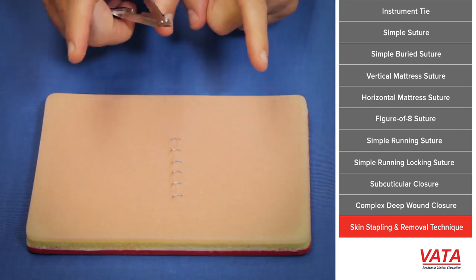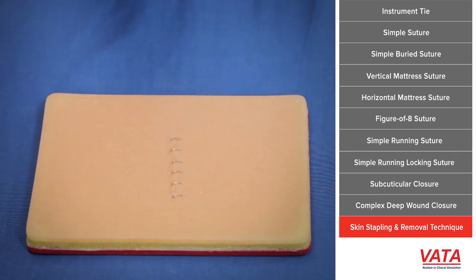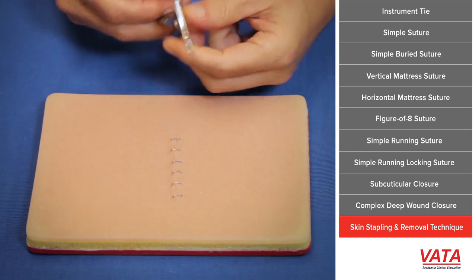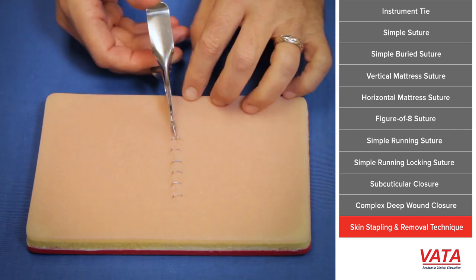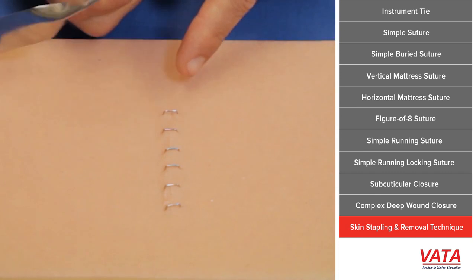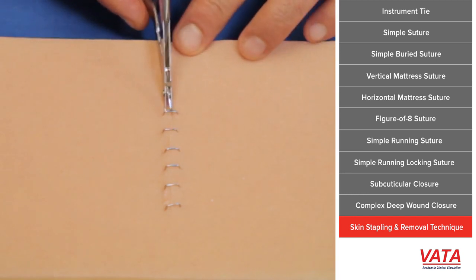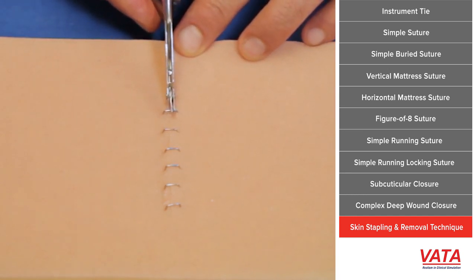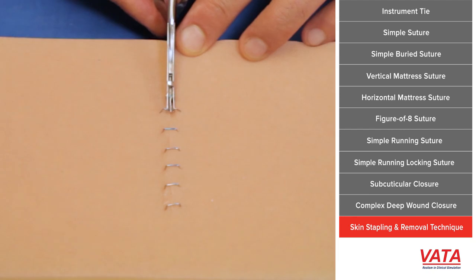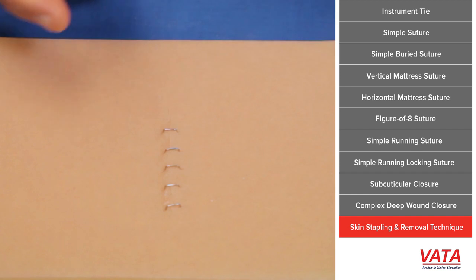How do we take these out? This is a staple remover. Basically, it'll grab the staple, which has turned its edges in to approximate, and will open the edges of the staple and straighten them so they pull right out. As you push down on the staple remover, it unbends those ends of the staple, aligns them so they become straight, and then the staple will simply lift out of the wound. We push down, it spreads, and as it straightens, it just pops straight up.